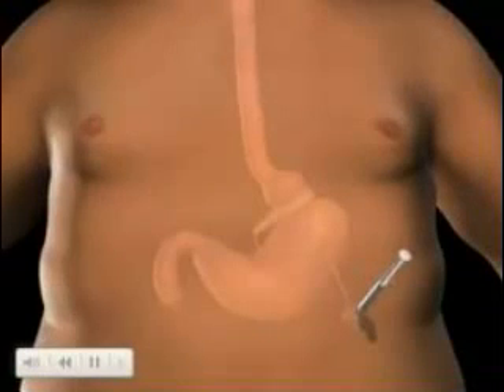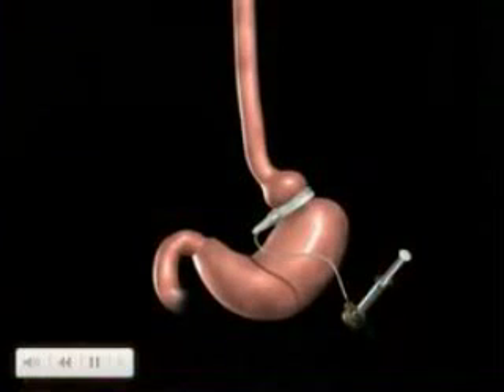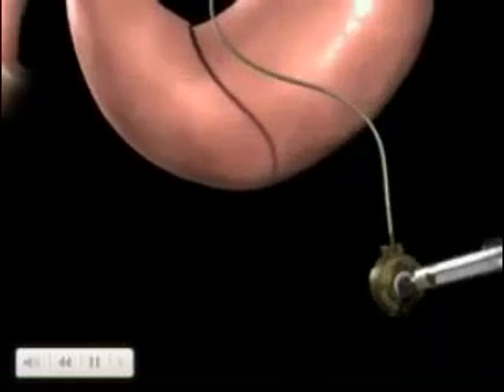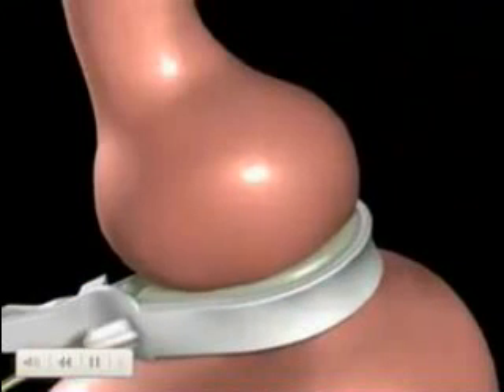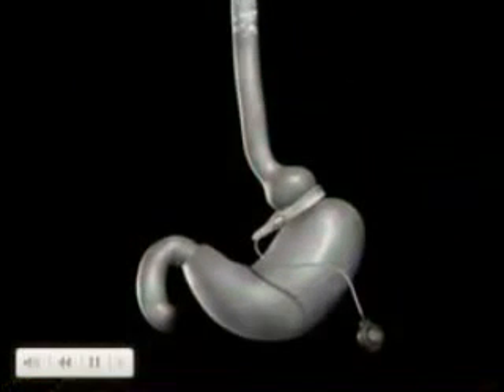Your surgeon may tighten the realized band by injecting saline into the injection port. As the saline is introduced to the realized injection port, it travels through the tube to the band. The addition of saline to the band creates a smaller upper stomach pouch, which restricts the amount of food you can eat before feeling full.